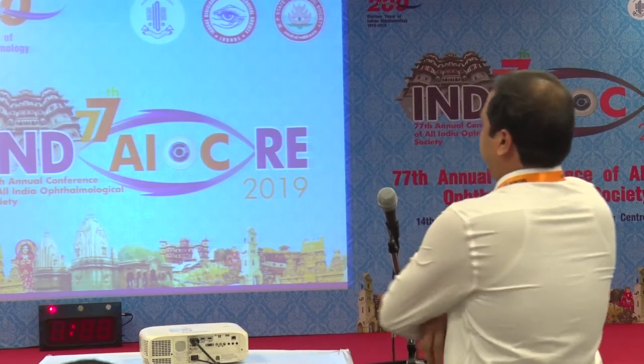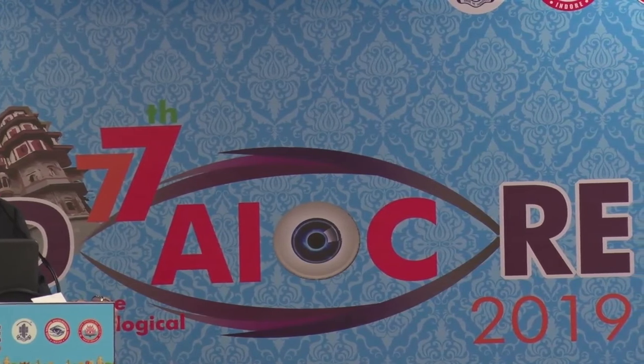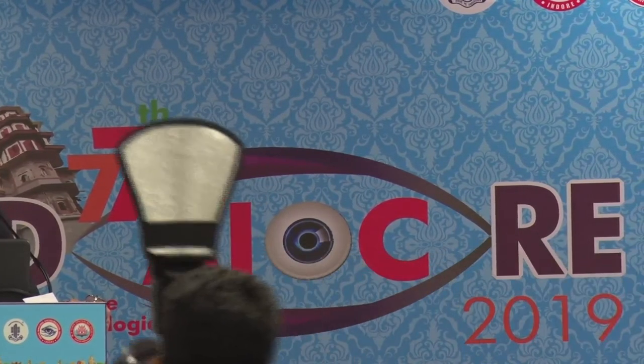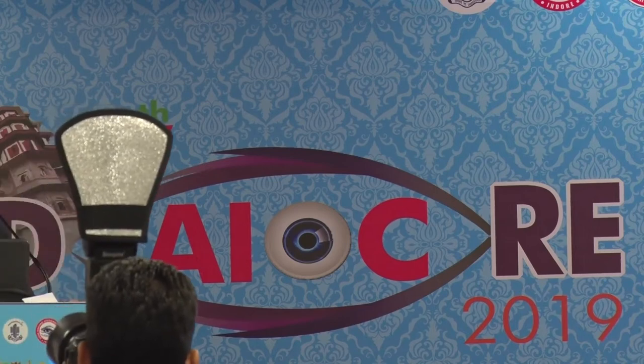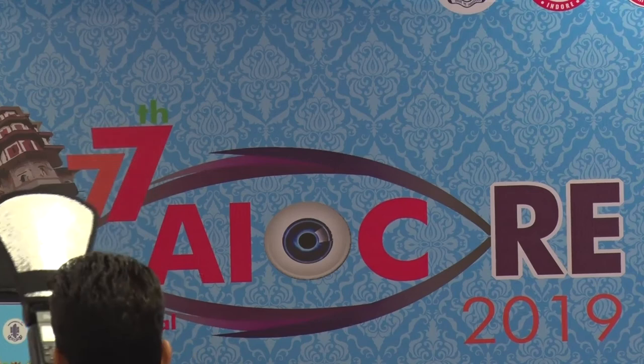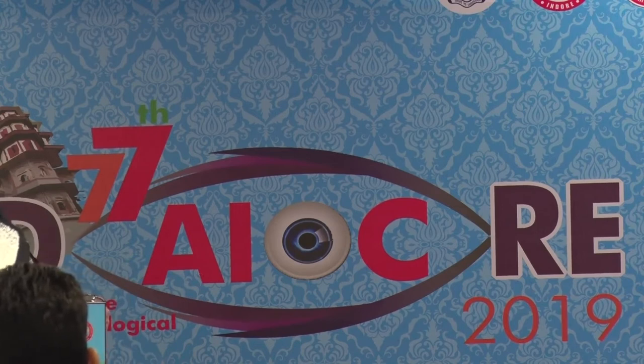Yeah, I think that's very important. You asked a very important question. That is where perhaps we have learned over a period of time. That means despite your buckle, whatever surgery you have done, your retina is still not relaxed. It's shorter. So what many people do, they have talked to me, is put in a PFCL, try to do more manipulation, try to compress, and it doesn't work. So the best is, if it is not getting relieved, if there's an obvious membrane, try to remove it. But most of the time, if not, what we have realized is that we just go directly over that area, cauterize that area, make it a little limited, till the time you have that short retina, like a retinectomy. So it will come out, it will relax, because the band is also already there. So that is the easiest thing in such a situation which you are describing.